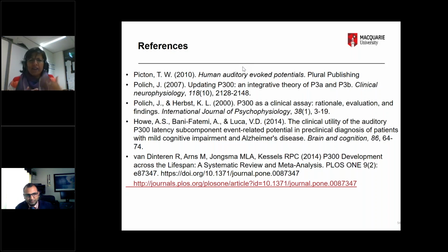He had a notch, but then he was in industry, etc. We didn't know what he was able to perceive or not. So the one thing we should have done and didn't do could have been the P300. We did the cortical responses. We did the ABRs. ABRs were quite nicely aligned with the PTA. But that's where P300 can be useful.